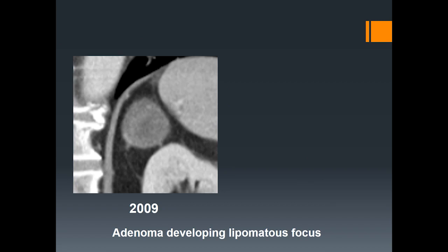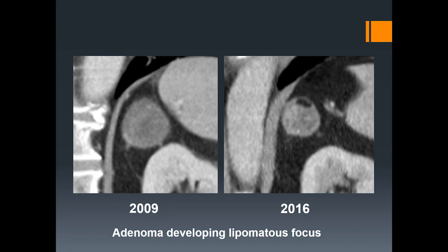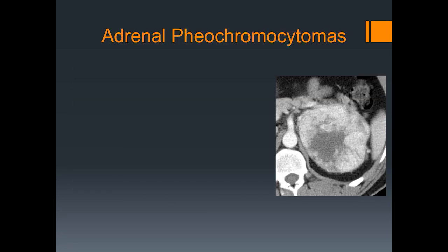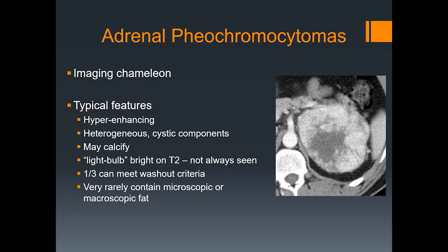This is a case of a proven adrenal adenoma that in 2009 was entirely soft tissue density; however, the patient returned for a CT seven years later and had developed a small focus of macroscopic fat within the tumor. Moving on to adrenal pheochromocytomas — these have been termed the imaging chameleon due to their wide variety of appearance. Typical features include a hyper-enhancing, heterogeneous tumor that may have cystic components. Calcifications are possible, and the classic MRI feature is the lightbulb appearance on T2-weighted imaging, though this is not always seen. About one-third of pheochromocytomas can meet washout criteria, so the specificity of washout is not 100%.